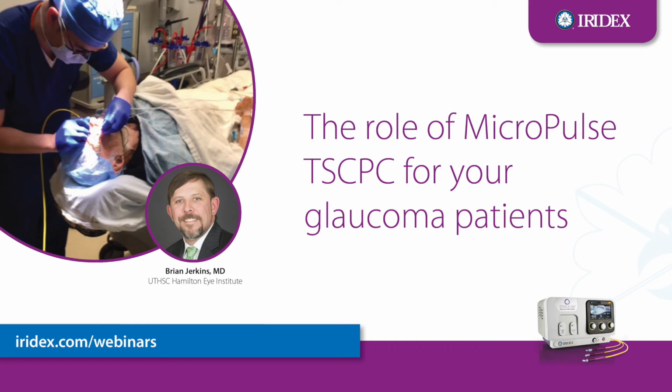Okay. Have you used a G-probe and done continuous wave procedures, and how did you settle on MicroPulse as your procedure of choice? I've done G-probes in the past. I don't think I've done one in the past 2 years, but I had utilized those a lot in the past. And as we're all traditionally taught and are used to doing it, that is more an end-stage glaucoma procedure, very high pressures, no other options, blind eye kind of treatment that frankly is, even when done correctly, does have some discomfort and some post-operative pain. And once I started doing MicroPulse and I compared them back and forth a little bit, the MicroPulse patients not only were doing great, but they were extremely tolerant of the procedure. And that's what sold me on it, I'm getting great results.